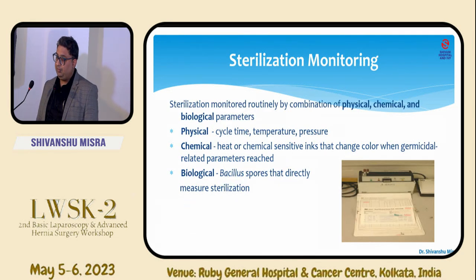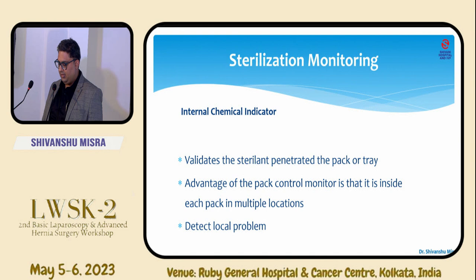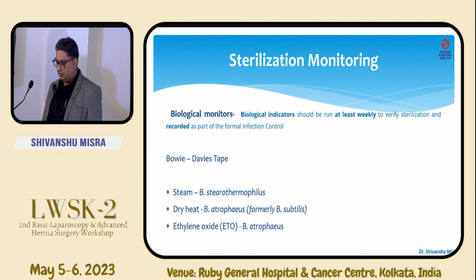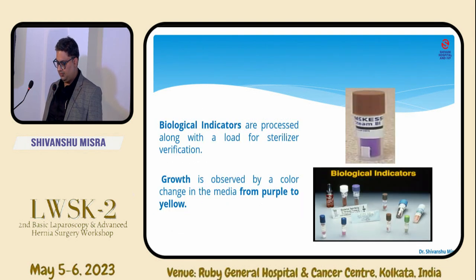Sterilization monitoring. It should be done in a rigorous way by physical, chemical, or biological parameters. Most important is the biological, in which bacillus spores are used to measure the sterilization. And there is an internal chemical indicator, which should not turn black, and that should be done once weekly in a proper hospital institutional setup. Usually the Bowie-Dick tape is there, and if we use steam sterilization, Bacillus stearothermophilus is used. If dry heat is used, then Bacillus atrophaeus is used, and in case of ETO, Bacillus atrophaeus is again used.